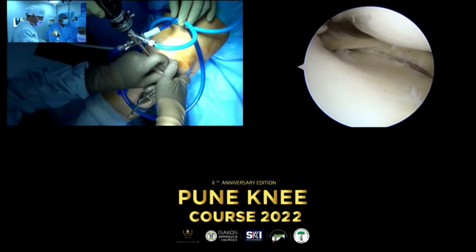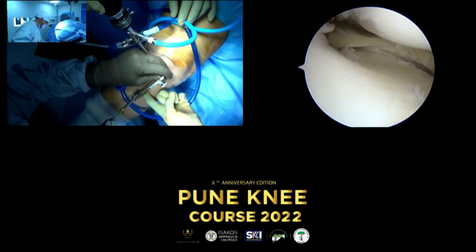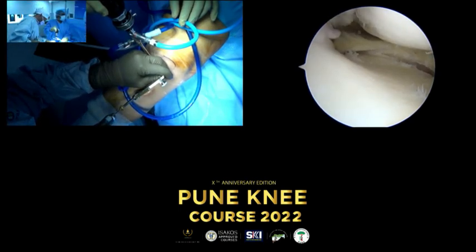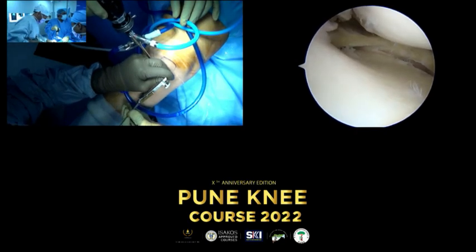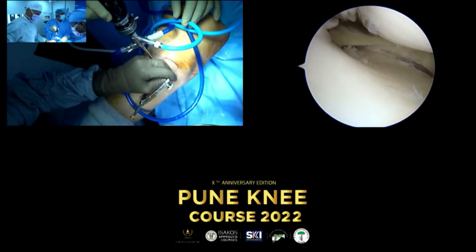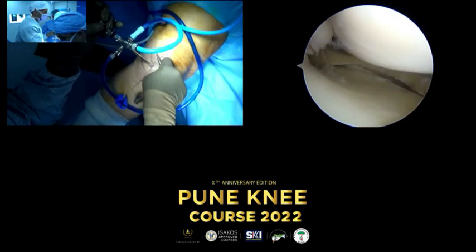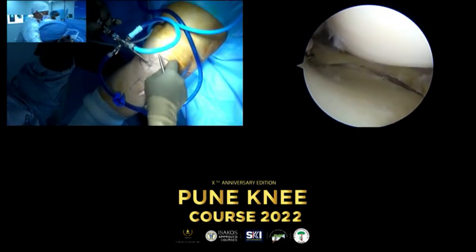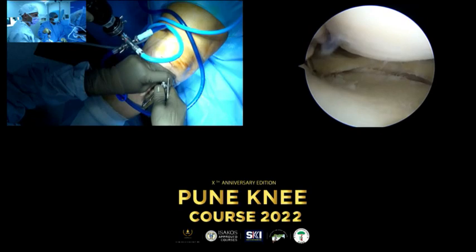The degree of the guide right now is the lowest one. It's around 35 or 40. Probably there is the screw here. I think this is the screw we changed. I was going to say how accurate this guide is, but we will change everything. When this happens, you have to change the setup. We go again. Okay, can you hold the camera? Let's see. Okay, third try.